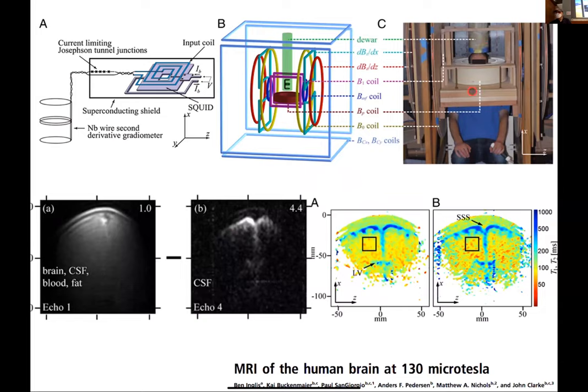I'm not sure this will really take off, because SQUIDs are a superconducting technology and they require care and feeding and things like that. I'm not really sure how far this will go, given that there are other technologies that are much easier to maintain. But I think it's an interesting idea to show how low you can go in field strength.